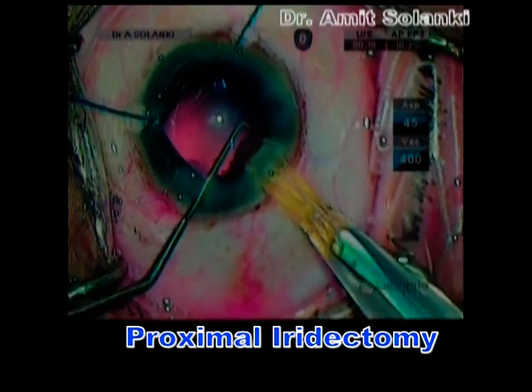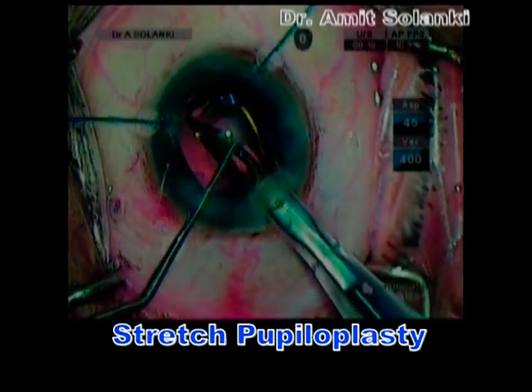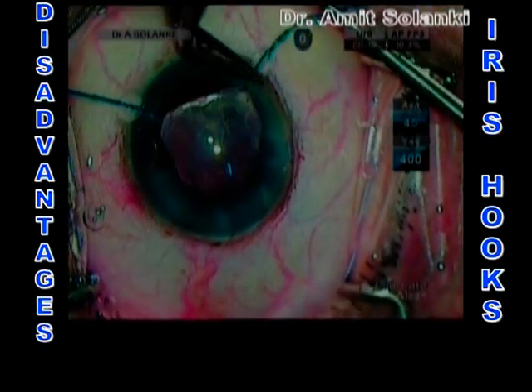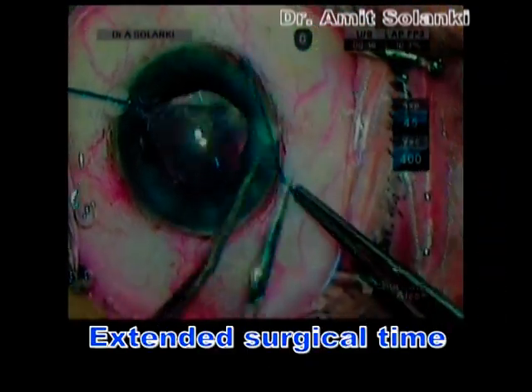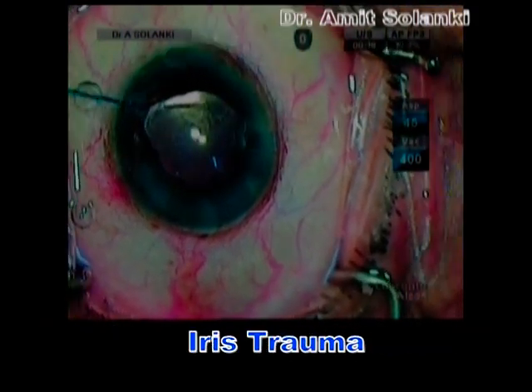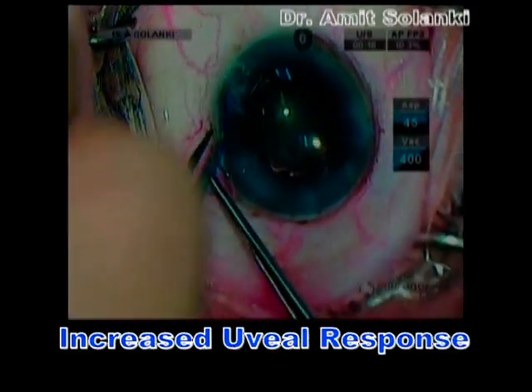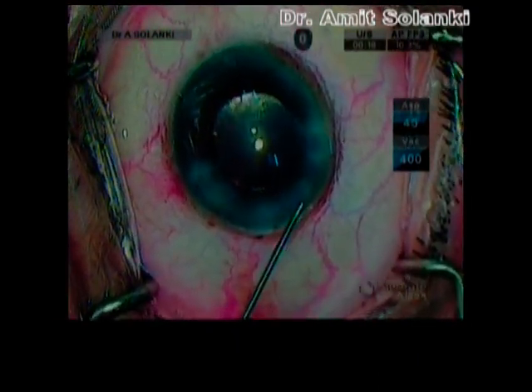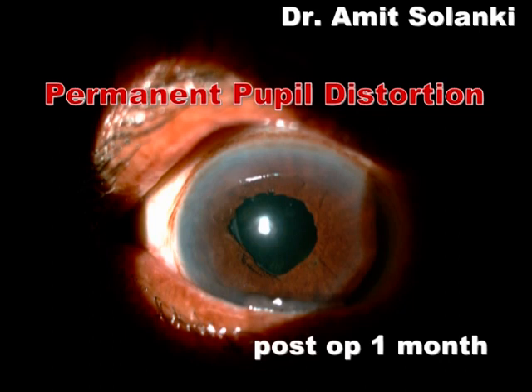Most of these techniques provide adequate pupillary dilatation. However, they also suffer from some disadvantages, such as extended surgical time, new incisions, cost, iris trauma, increased uveal response, and permanent pupillary distortion. This is the one-month postoperative picture where you can see the permanent pupillary distortion, which may lead to glare and photophobia problems.